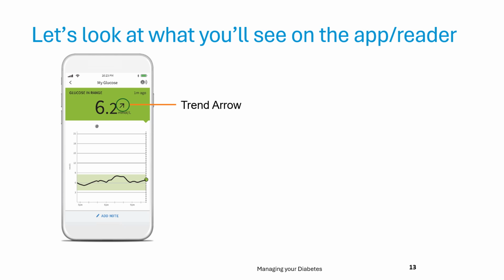And I'm also going to see this dot here is what the glucose level is now on a graph, and then what the past 8 hours have looked like. So it shows a reflective view of what their glucose levels have been. So that's the rear view mirror.